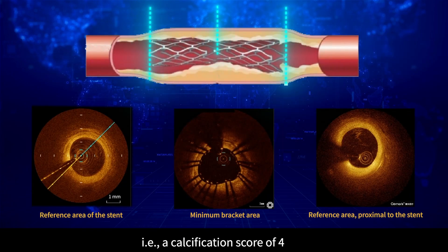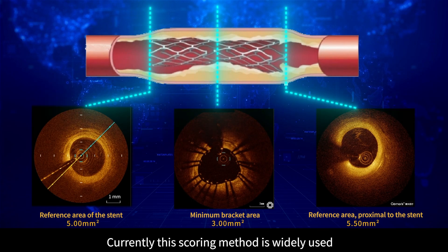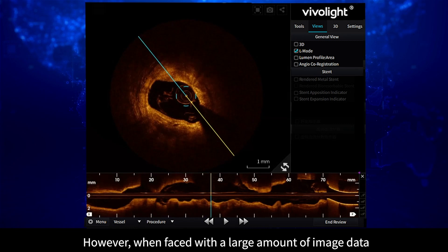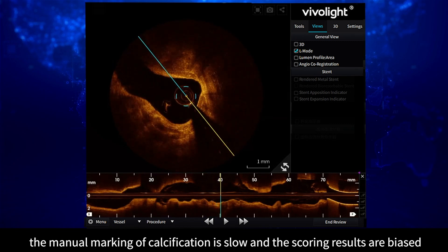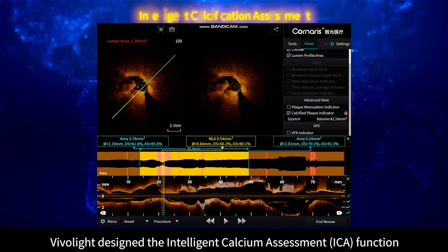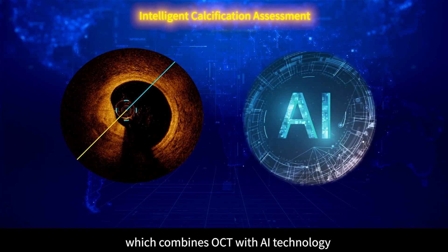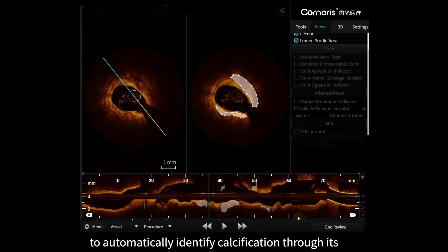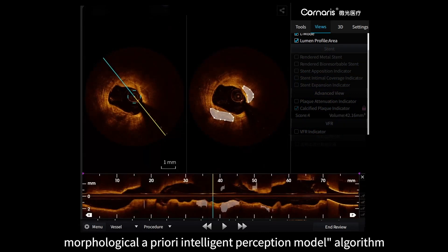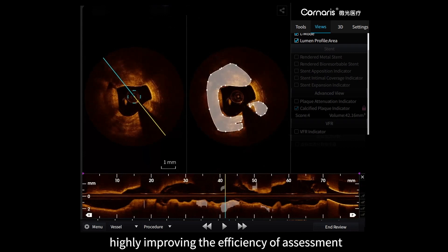This corresponds to a calcification score of 4. Currently this scoring method is widely used; however, when faced with a large amount of image data, manual marking of calcification is slow and scoring results are biased. To address this clinical pain point, Vivolight designed the Intelligent Calcium Assessment (ICA) function, which combines OCT with AI technology to automatically identify calcification through its morphological a priori intelligent perception model algorithm, highly improving the efficiency of assessment.